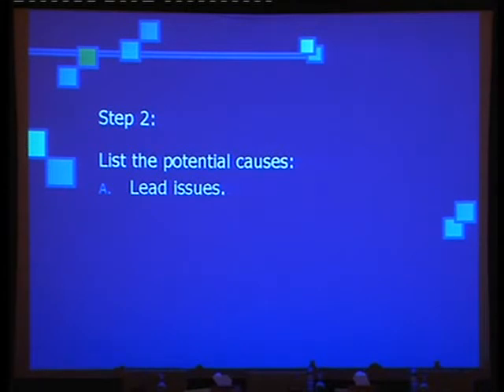We have two kinds of dislodgement: a micro dislodgement and a macro dislodgement. Macro dislodgement can easily be detected in the X-ray, but micro cannot be detected. So this is one of the first problems that can occur, or reasons, a lead problem.